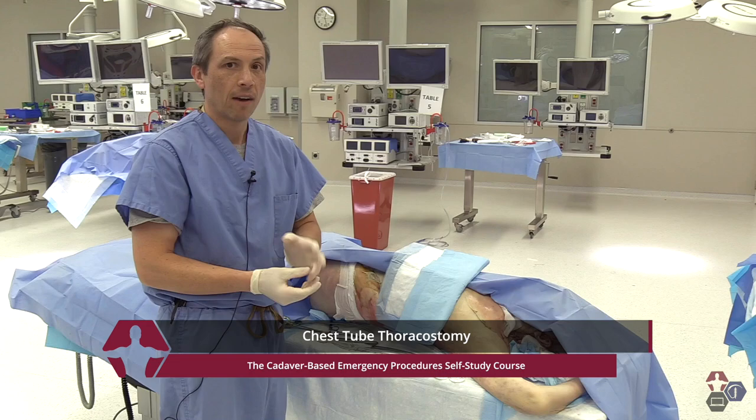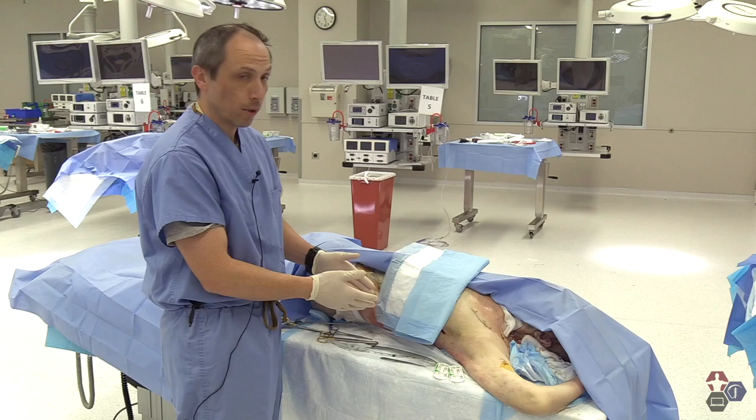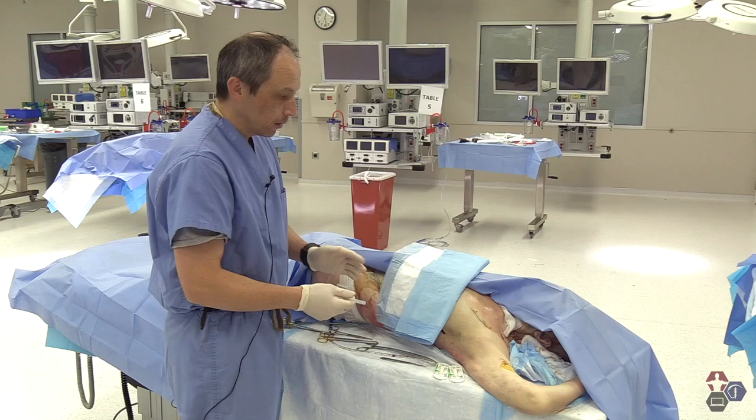So what are the real indications for doing this? Well, it's to evacuate any type of air or fluid from the chest cavity. And there are really two ways of doing it: one is either through a needle insertion into the anterior chest, or two is through a traditional chest tube through the lateral chest wall. With some of the new technologies and new tubes that we have, they're a little bit interchangeable, but we'll do the two traditional methods.